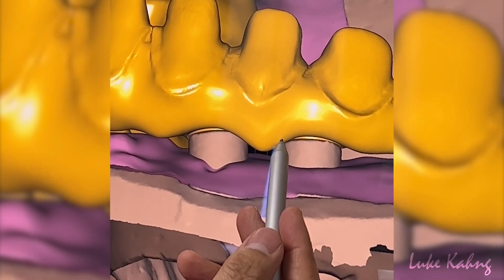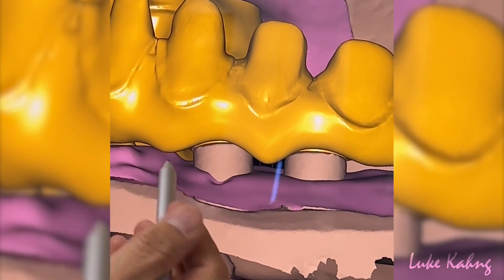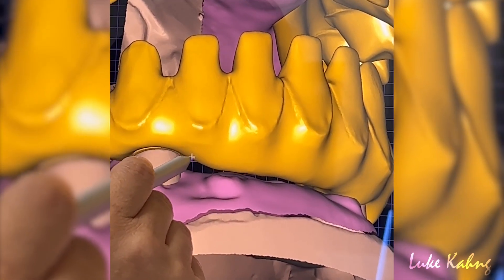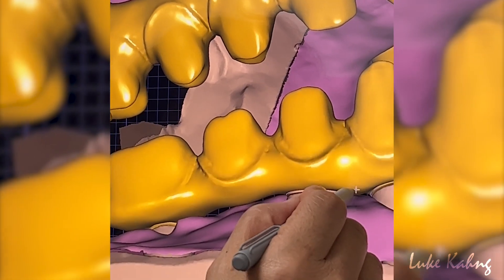You can deal with the cover more and cut it in that area or cut it in that area higher. A little bit here too. I'm talking about underneath now. This one too.